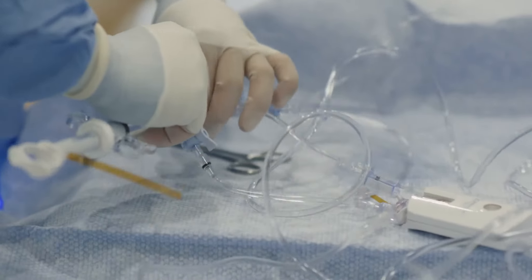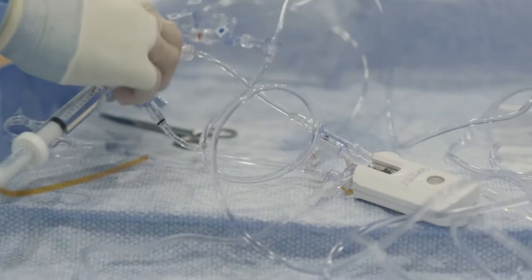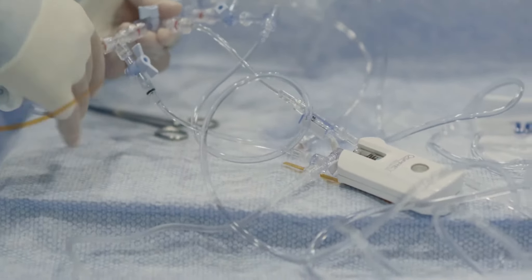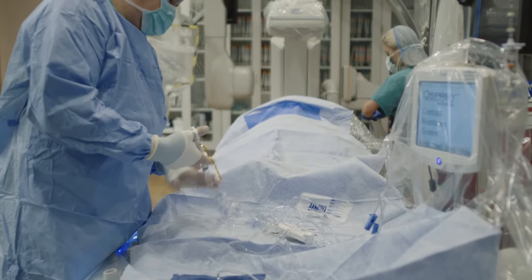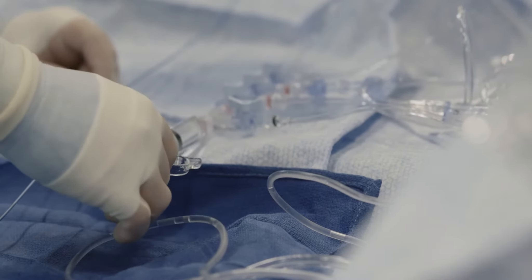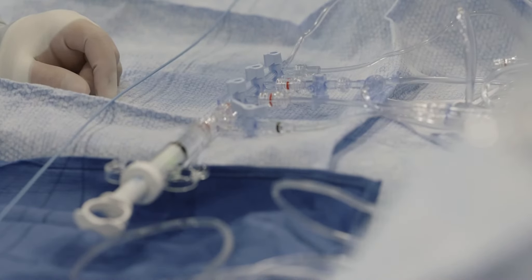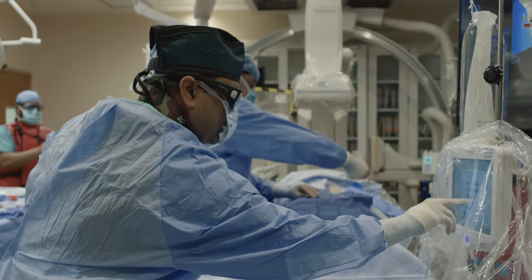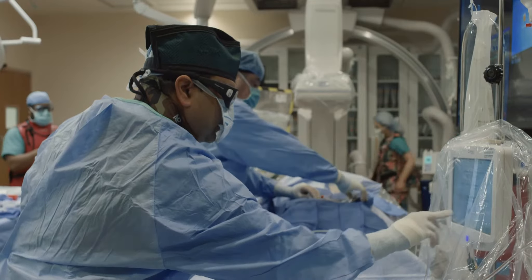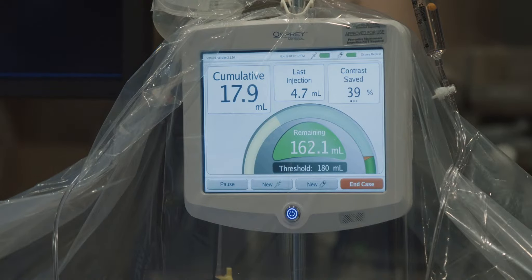The Divert module easily attaches to any standard manifold configuration. The Divert Smart Syringe is connected to the manifold and is used for contrast dye injections. The Divert Monitor displays in real-time the amount of contrast dye delivered to the patient throughout the procedure.